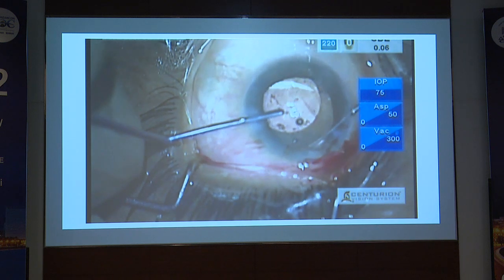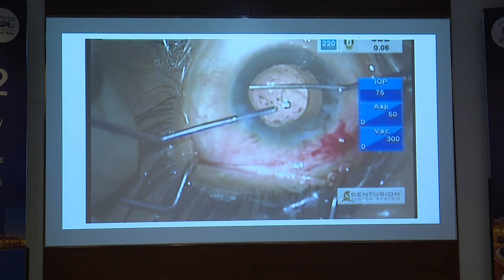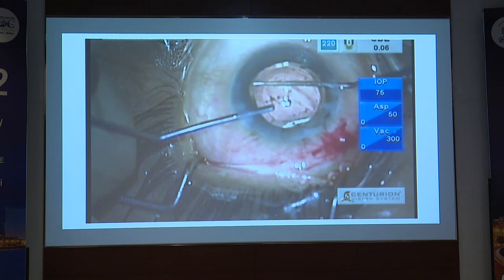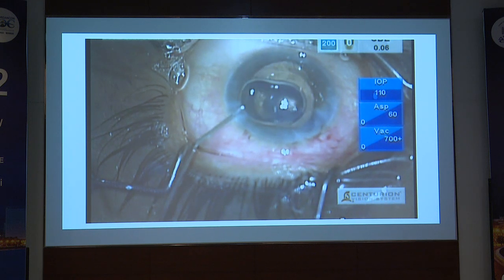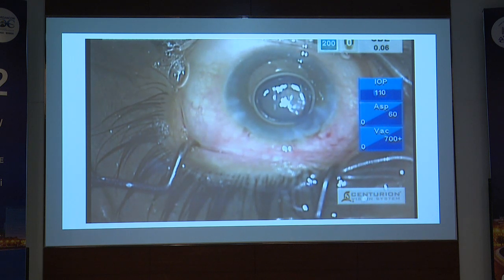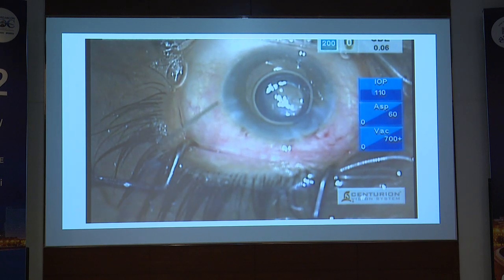In goes the IOL. I waited to see everything is moving okay. Is the capsular bag stable, or will we have to put in a Mehta segment? Mandatory air at the end of the case to see everything is good, no vitreous in the AC, and the case is over.